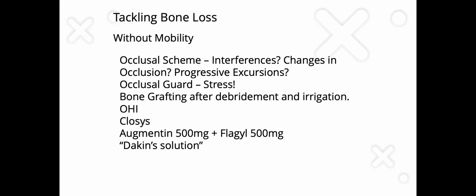And so let's say we are tackling bone loss right now. We see our implant, there's no mobility, but we do see that there's a challenge with bone loss. And adjunctively, I'm just going to say, when 70% of the population has some form of periodontitis, it's never going to be healed. It's going to just be treated long-term.